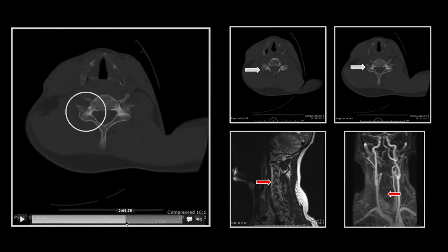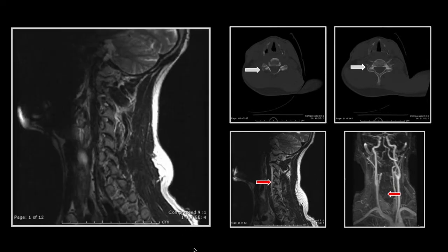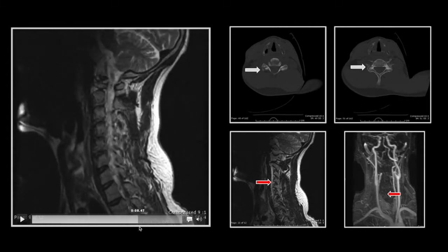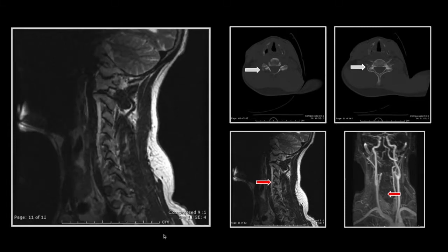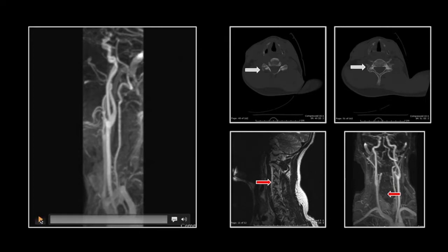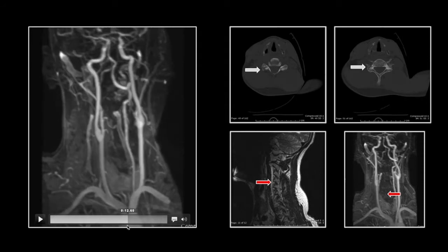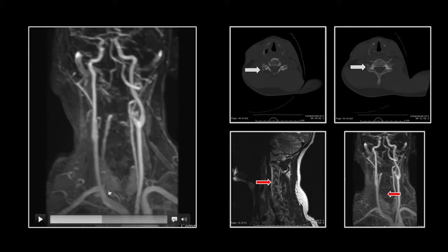Here is that fracture through the transverse process and associated foramen. Here is the normal vertebral artery flow void on the left, and the hyperintense vertebral artery on the right, consistent with dissection and thrombosis. Here is the 3D view — nicely showing the normal left vertebral artery and the absent right, with a little bit of retrograde filling at its superior extent.